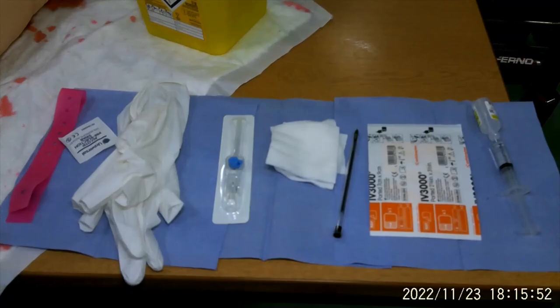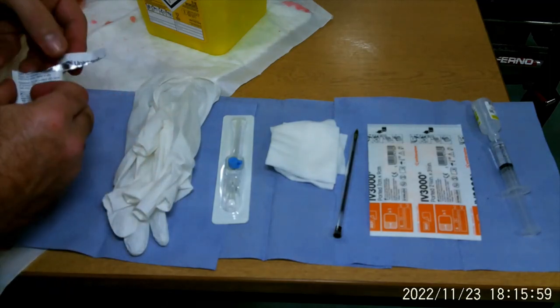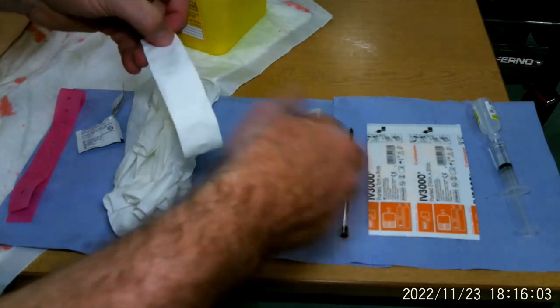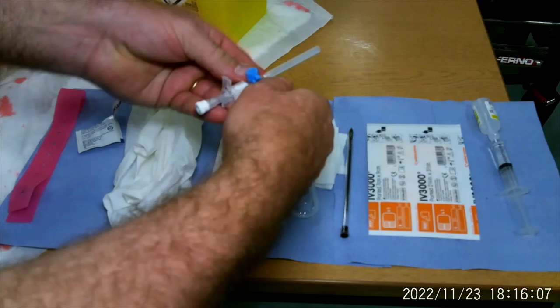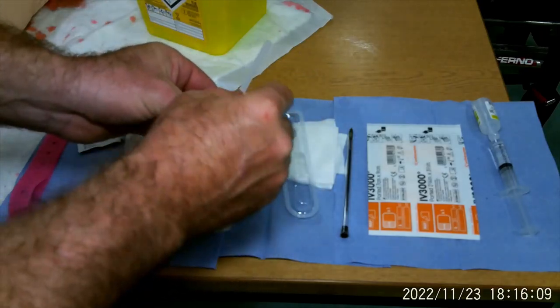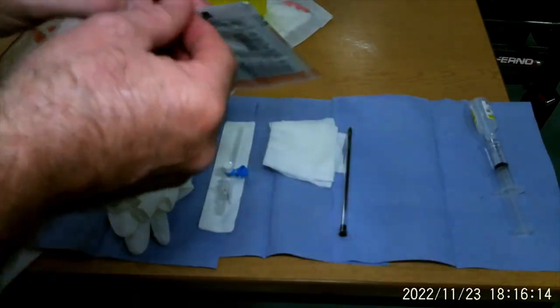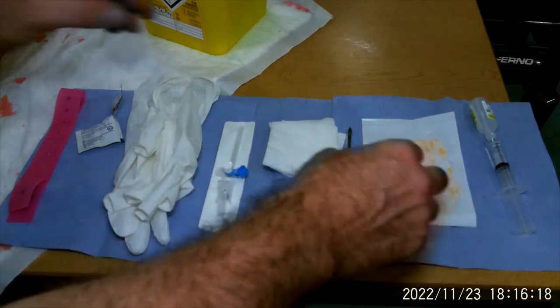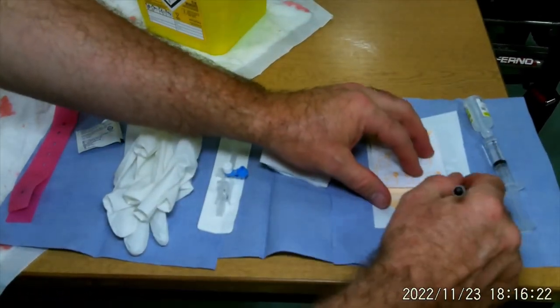So I'm just going to get everything open and ready to go for this OSCE. Just get my alcohol swab open, just get my cannula open. I always like to loosen the white cap — some people put it on the top port, that's fine. Get rid of that, and just my fixator. Lay that down. Don't forget about putting the date on there.